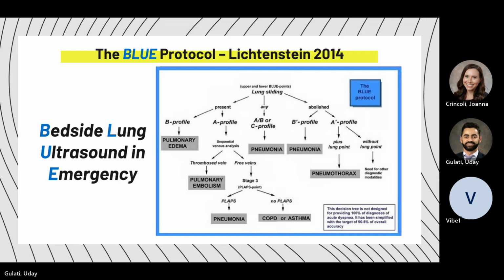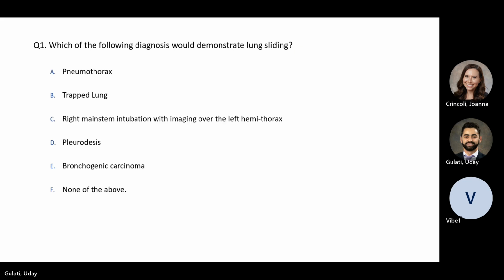I want to thank Dr. Green for these next set of questions. It shouldn't take that long. So which of the following diagnoses would demonstrate lung sliding?